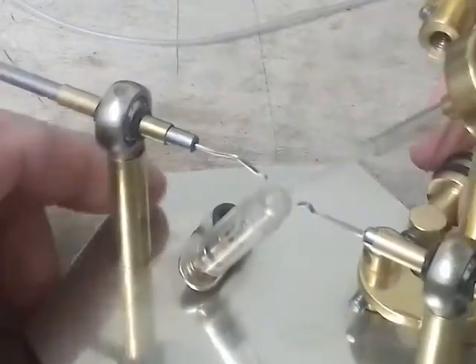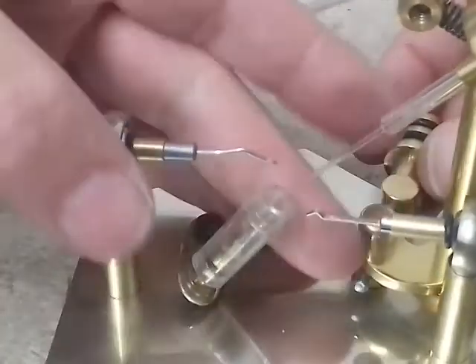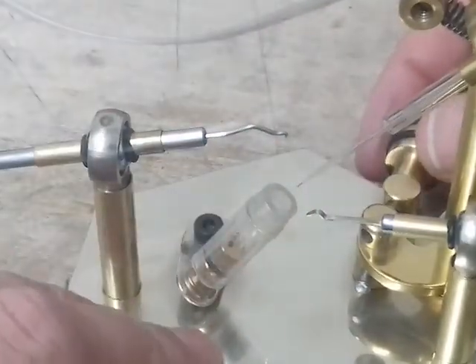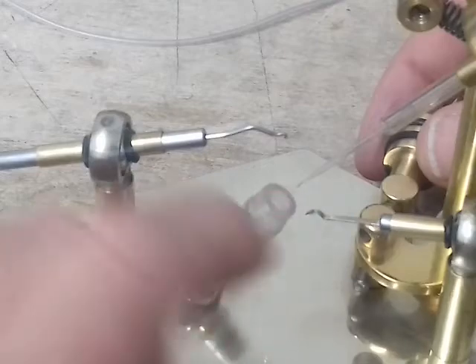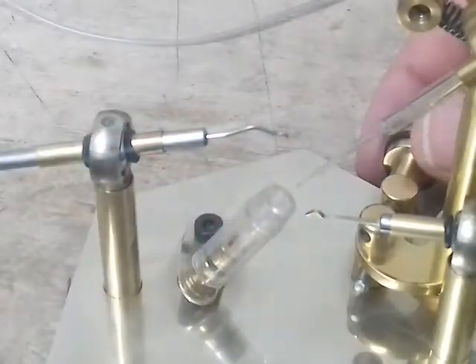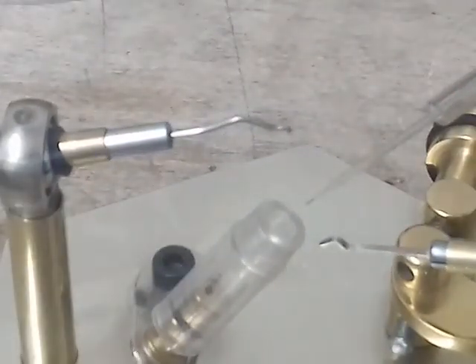And if I actually move that out of the way, you'll be able to see a bit better if I put my hand behind. There we go. So the end of the needle has a black marker on it, as you can see there. I'll try and zoom in on that needle and move the unit further down, make it clearer.